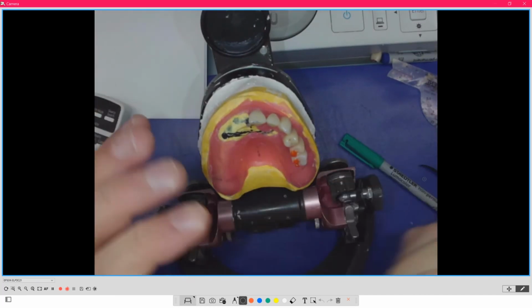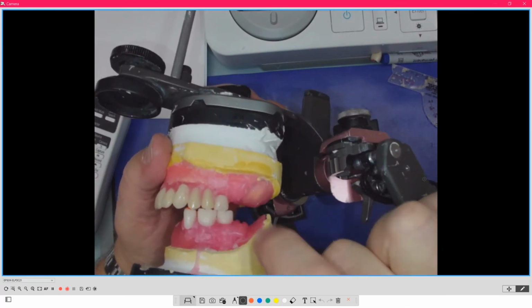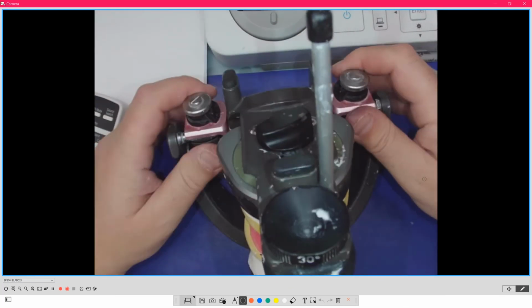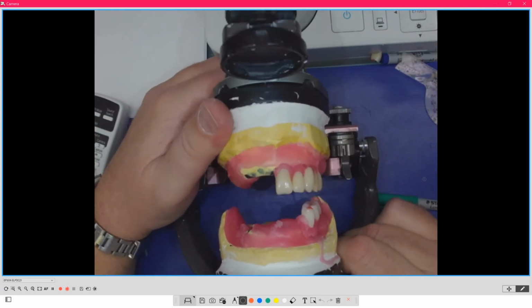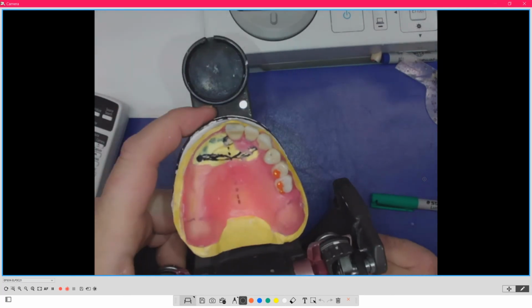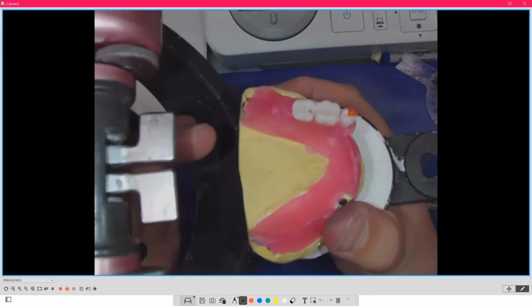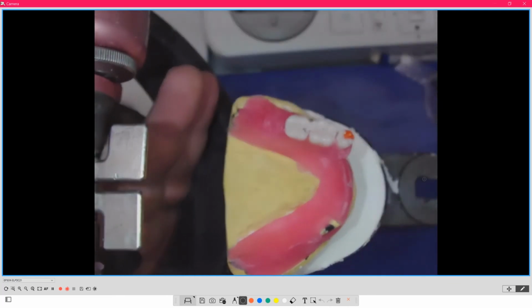However the setup goes, we're going to follow this approach where I did this mishmash of teeth. And the first thing that I'm going to check is your centric contacts. So that's the quick, just straight centric. And then I'm going to do this. So I'm going to bring this up so you can see. And let me hit focus. All right.